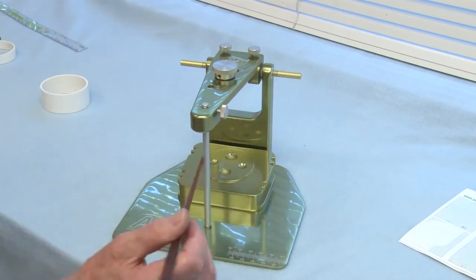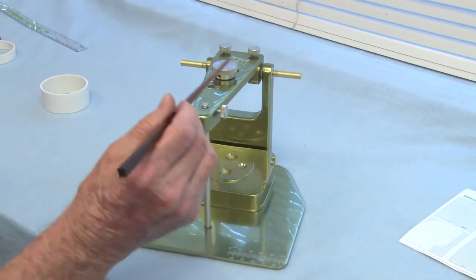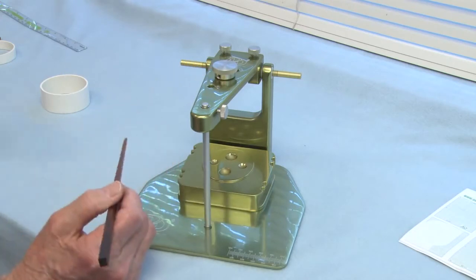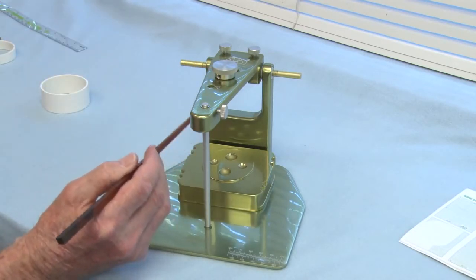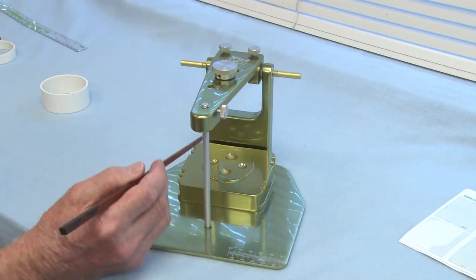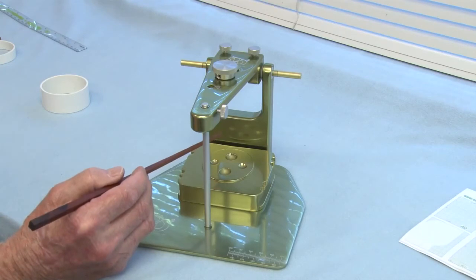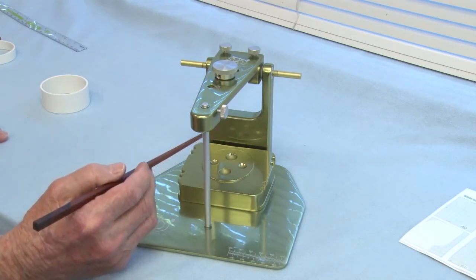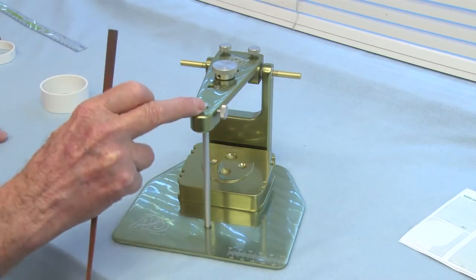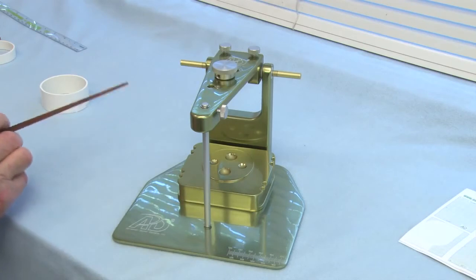And these notches are for rubber bands. You can hook a rubber band here, come up to here, and that then controls the setting dimension of the mounting stone. Plaster, mounting stone, all expands as it hardens. And for accuracy, you want to control the expansion, and so rubber bands can be used to control that expansion to keep the dimension more accurate.